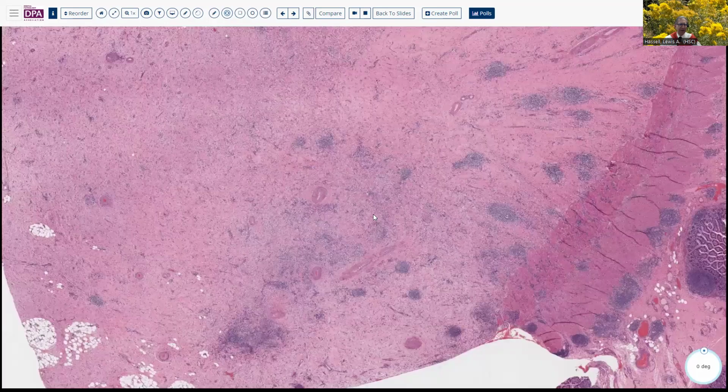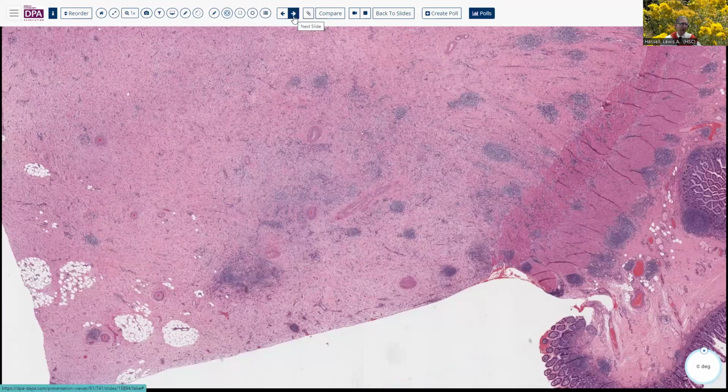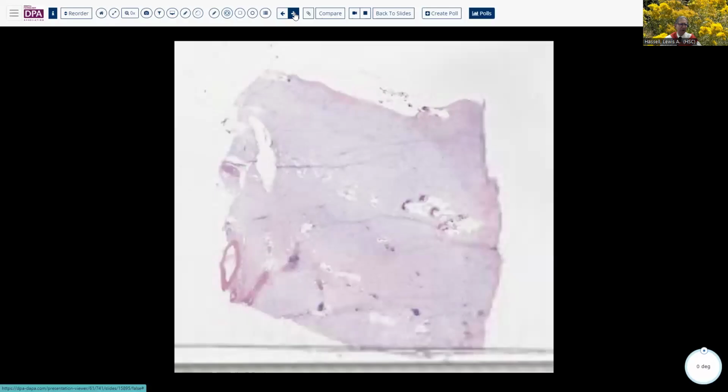And it's a potentially quite devastating disease because it does tend to affect the bowel and restrict motility, and creates a mass mimicking malignancy and so forth. This does not tend to metastasize, but certainly recurrence, if it's not properly managed, would be a great concern. And certainly secondary symptoms, morbidity due to bowel obstruction or dysmotility, would become an issue. Aside from the IgG stains, there's not anything else that's specific in this situation.